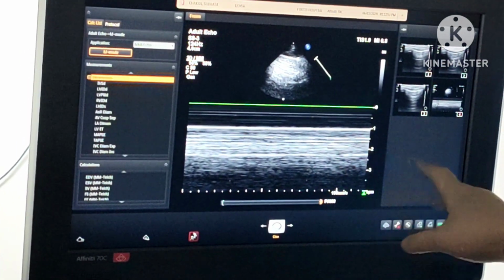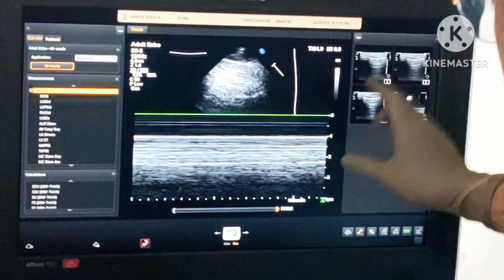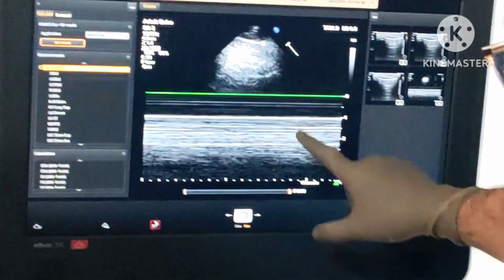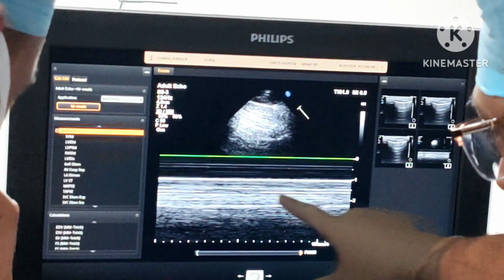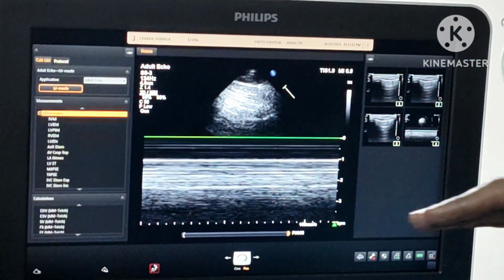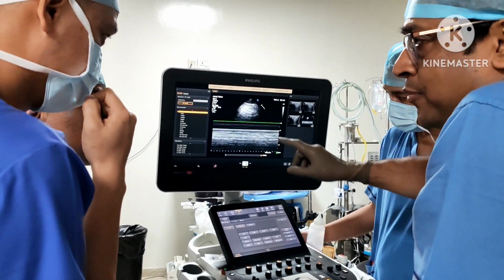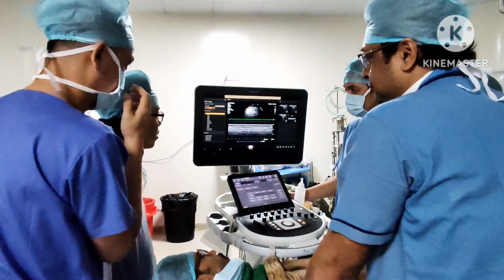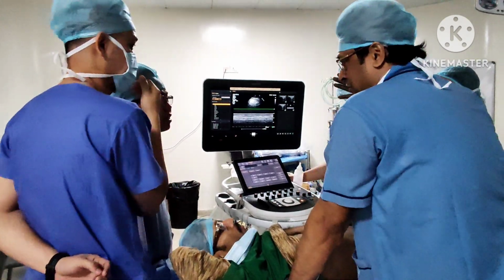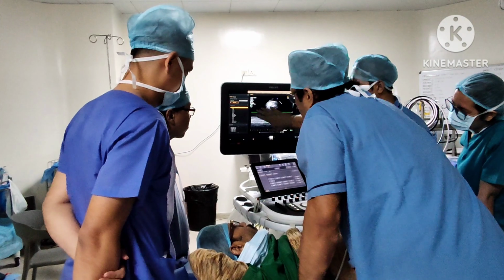If you look very closely, if I can zoom this, no, this won't zoom, but if you look at it, there are very thin vertical lines over here, right? So it's a texture which has both vertical lines and also horizontal lines. This is what you have to remember in your mind. This is the M mode of a normal lung. Maybe think of it as the sand in a seashore: this is the sand, and this is the interface where the ocean begins.